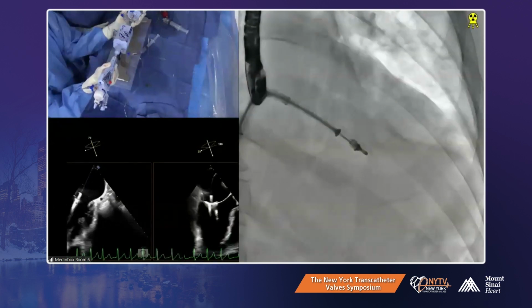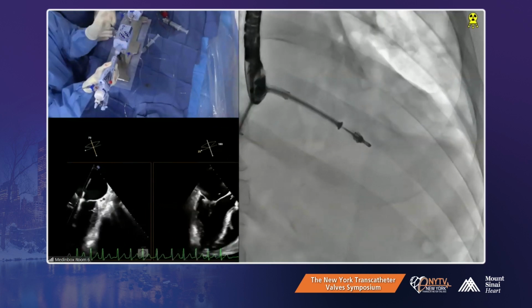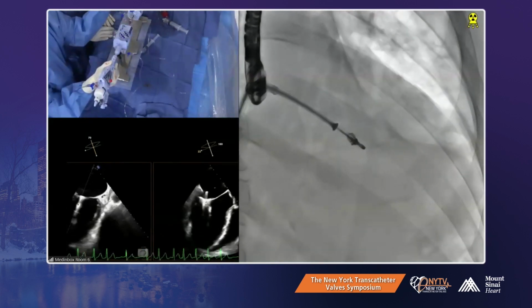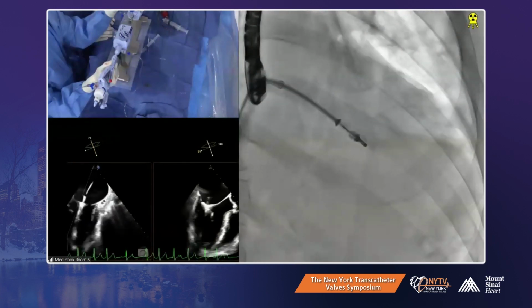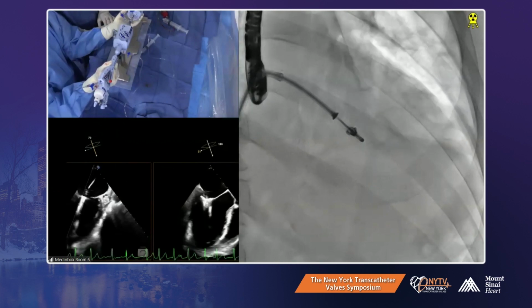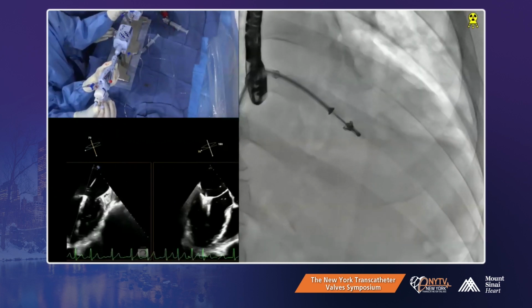Do you think we should change, if we change less plus? Yeah, you have to scoop under the posterior leaflet. Negative will allow you to do that. I see what you mean, but you're not worried about twisting the valve, right? Either we need to do way more plus or way less plus. I think we have to go less plus. We're doing less plus now.